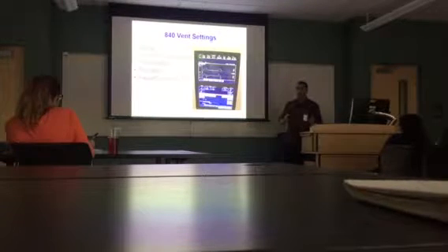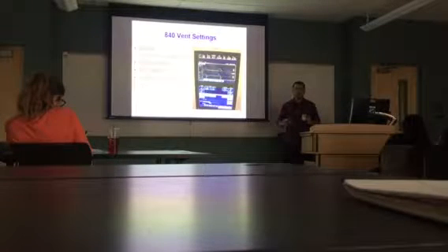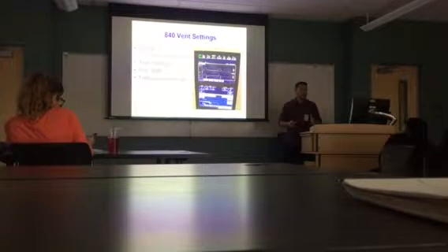The flow rate: how fast do I want to deliver this tidal volume? If a person is in distress, they want the help right away, so I'm going to give them a faster flow rate. Frequency is how many times a minute I will deliver this tidal volume.